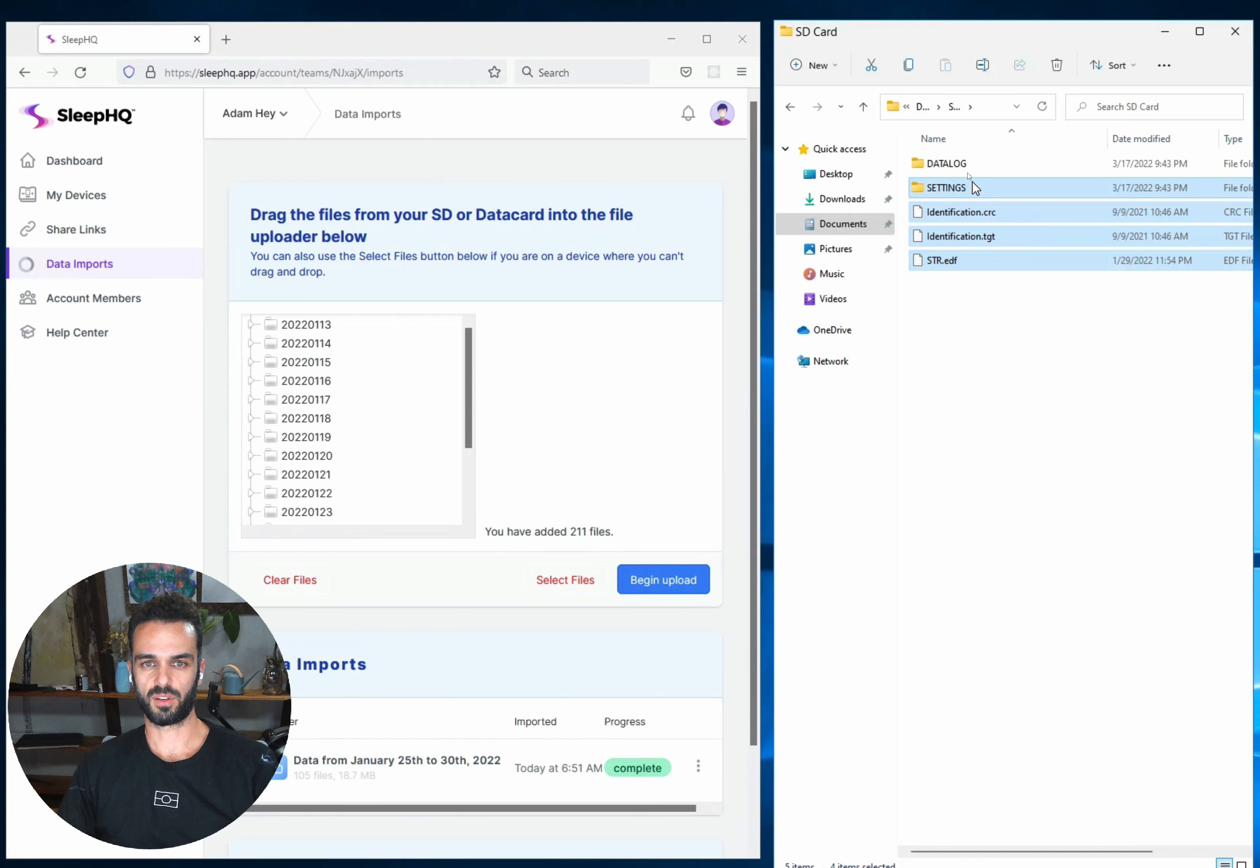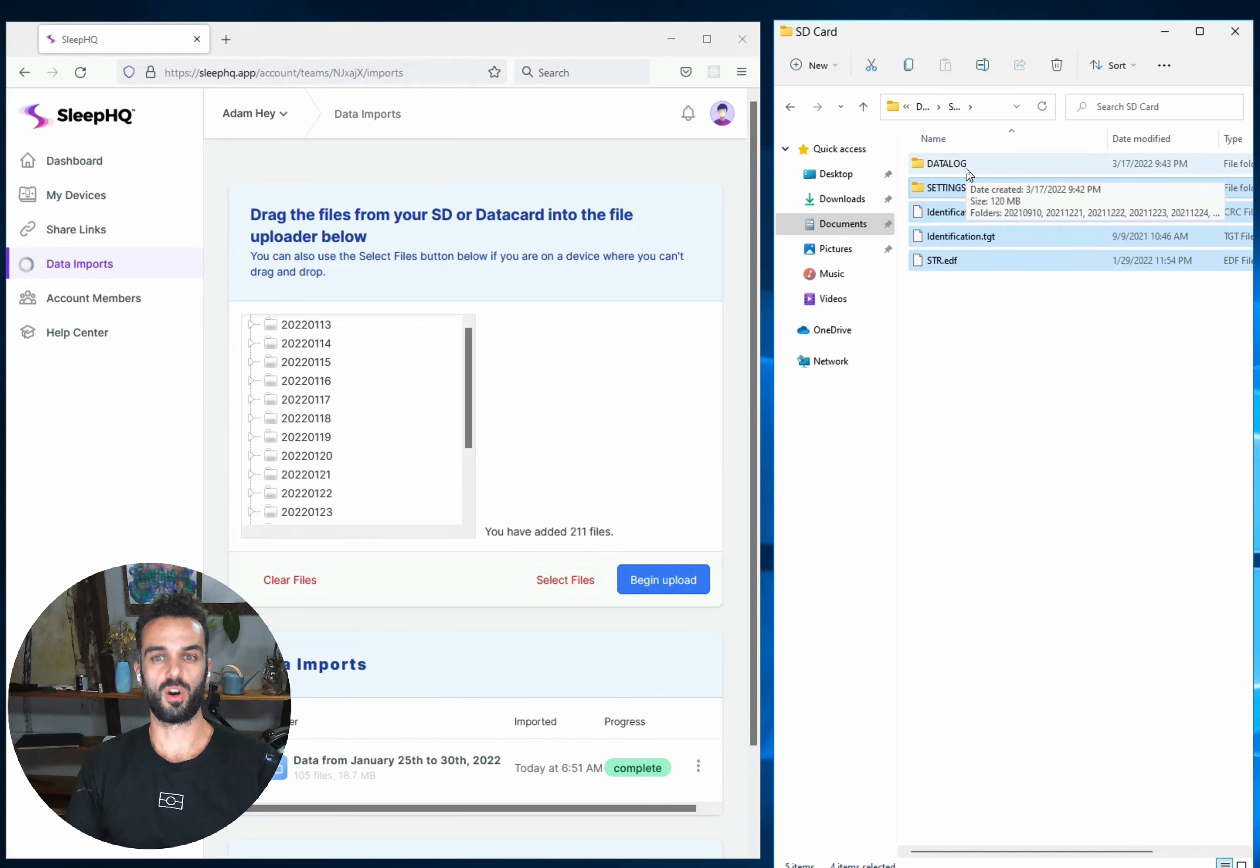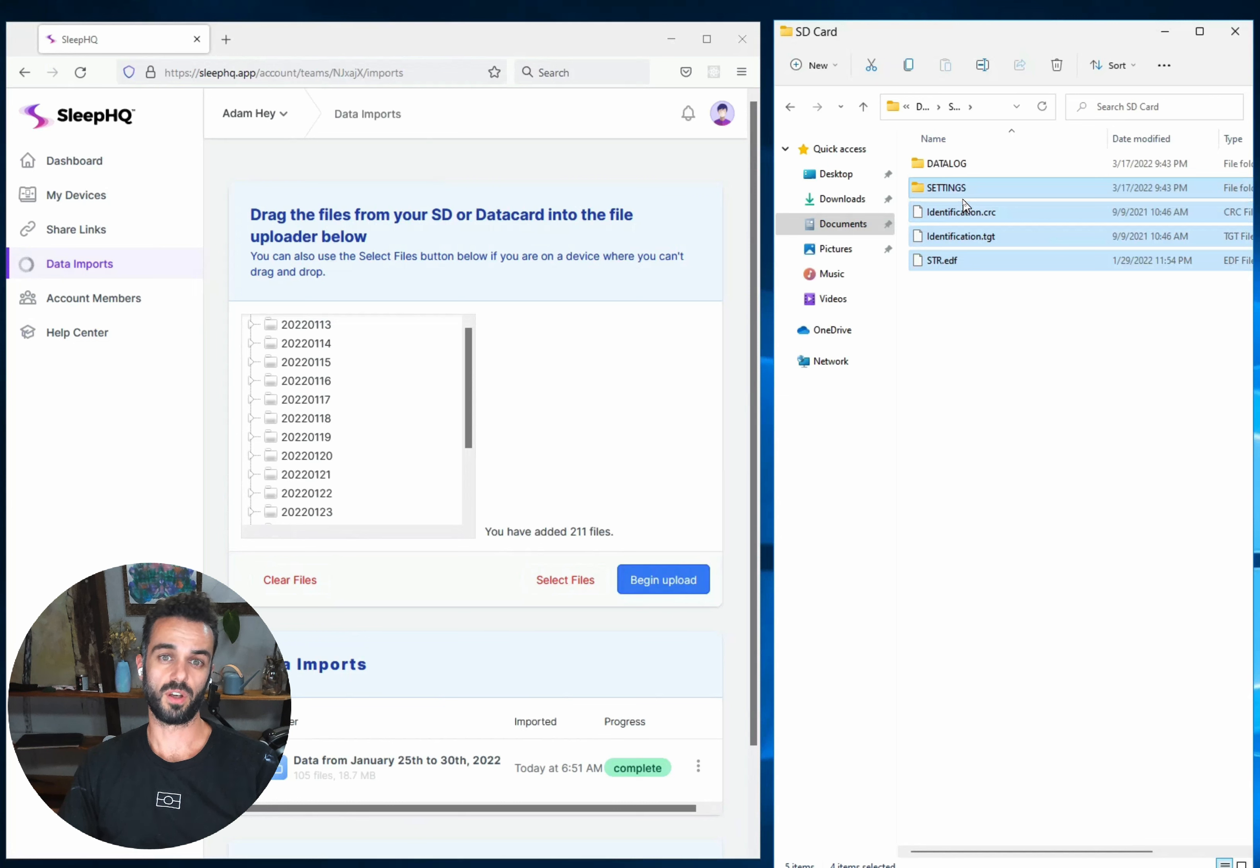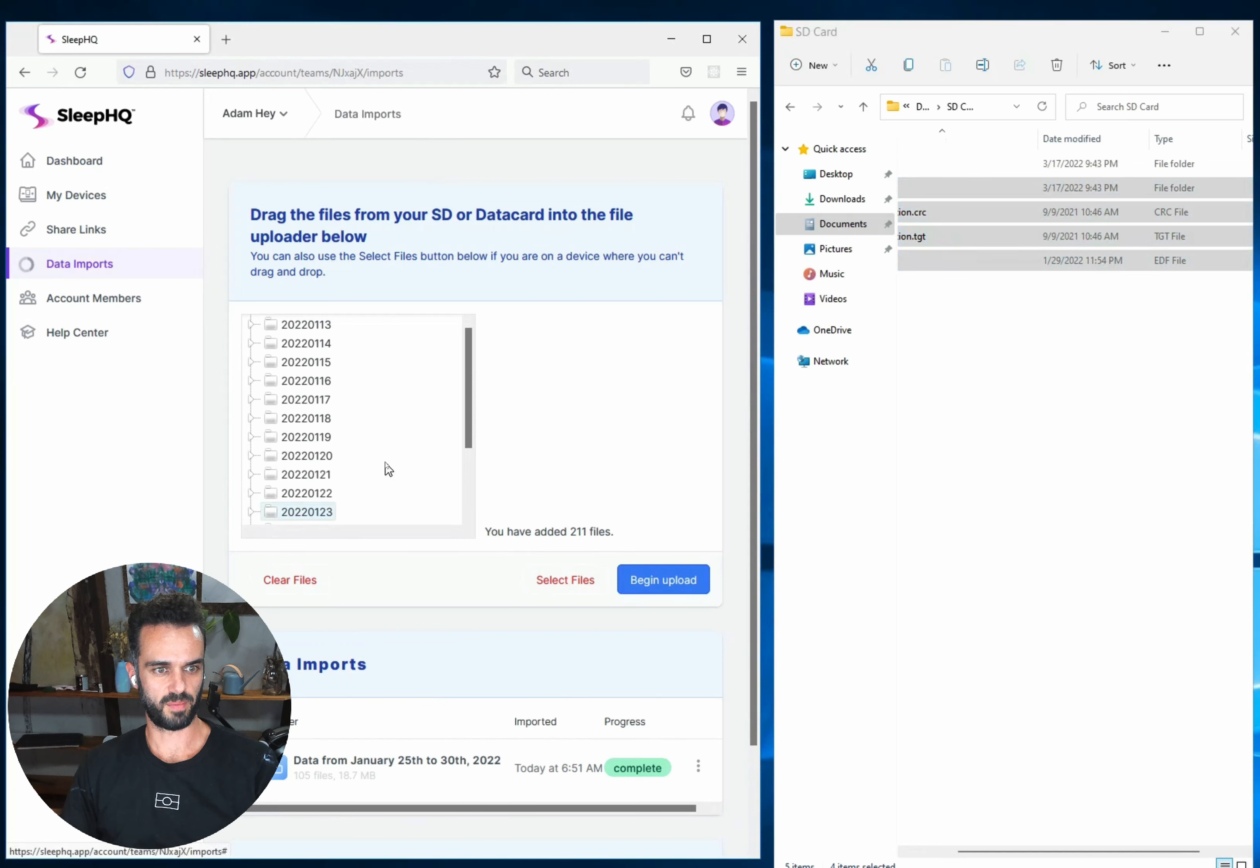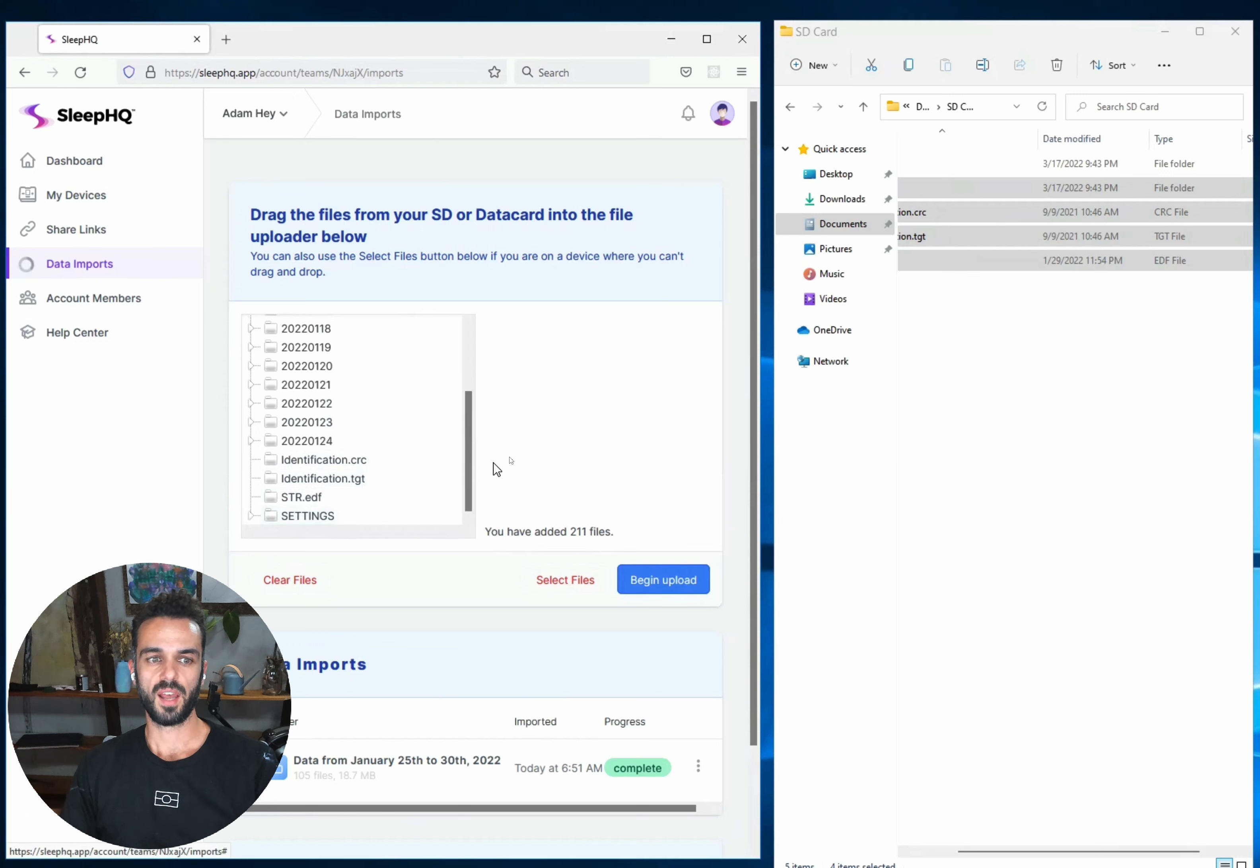The reason for that is because these are the files that tell us what machine to associate that data with. The Datalog folder, all that is, is the actual data itself, but you might have multiple machines. You might have a home machine and a travel machine. And so we need these other files so that every time you do an upload, we know which machine that data actually belongs to. So I've dragged those files in now and if I go over to my upload window, I can scroll down and I can see there they are there. I've got my identification, STR and settings folder.